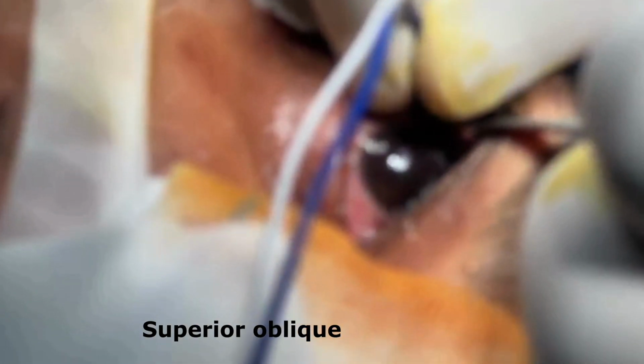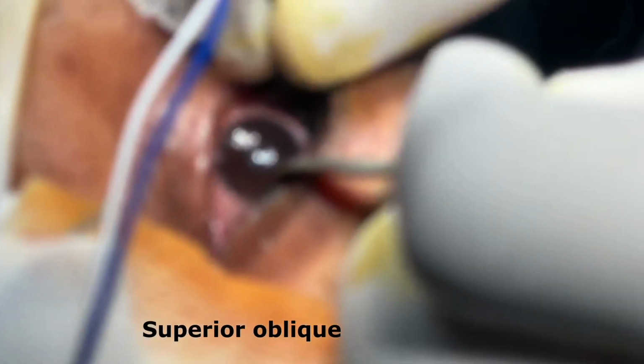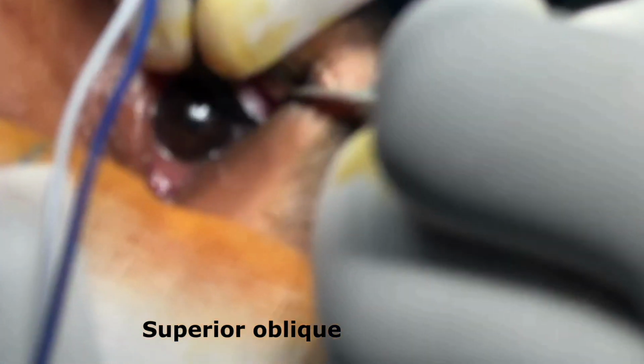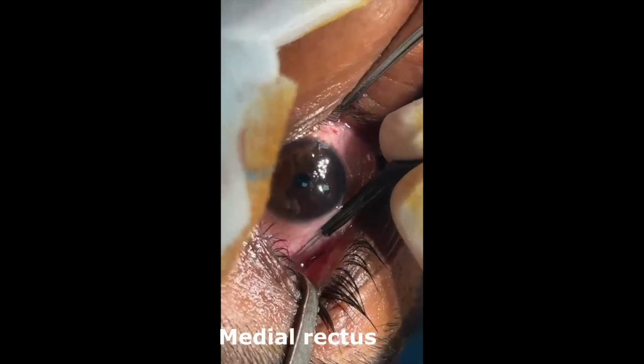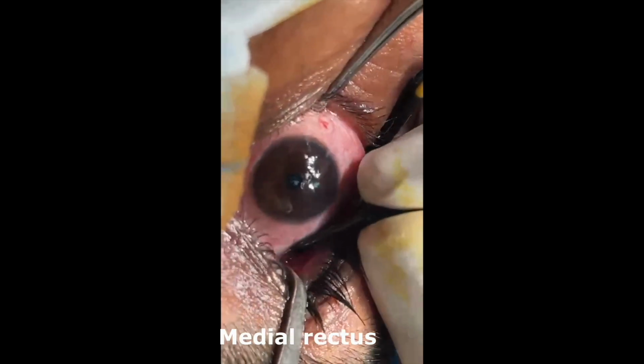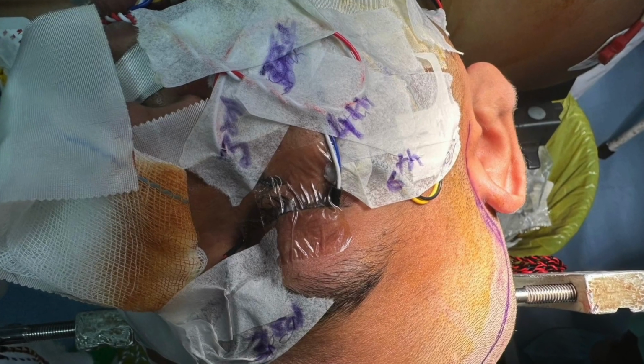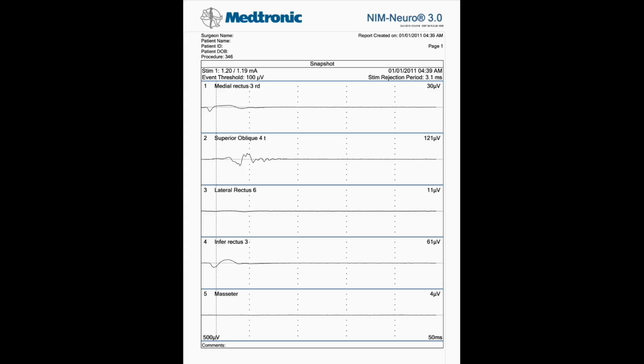This is to demonstrate the transconjunctival scoring of the superior oblique muscle. This part was done by our neuro-ophthalmology colleague. Medial rectus was also scored and this is the final positioning. This is the baseline compound muscle action potential showing no response with lateral rectus stimulation.